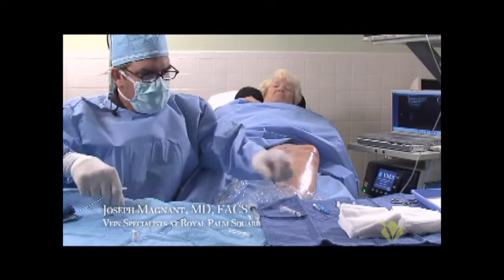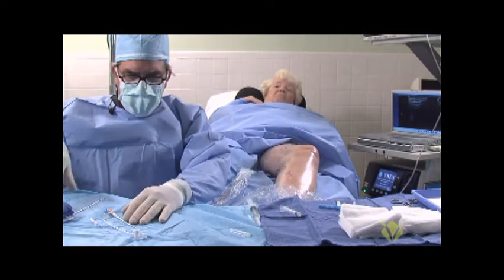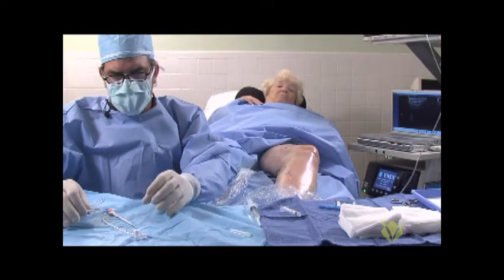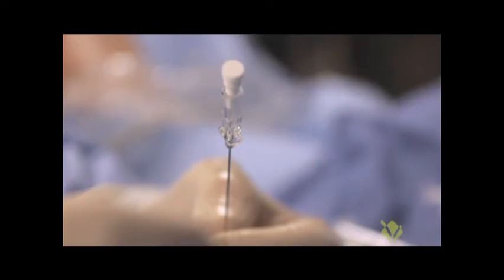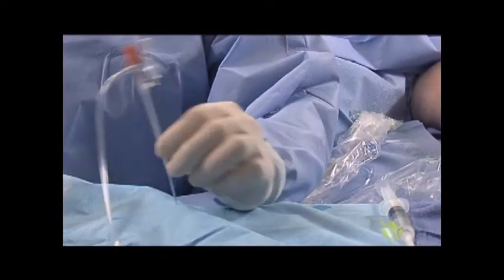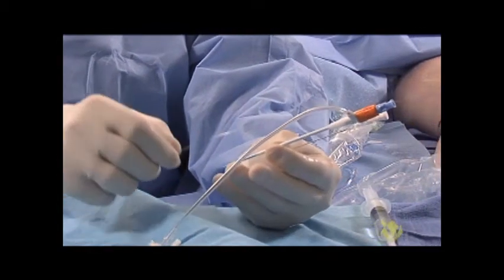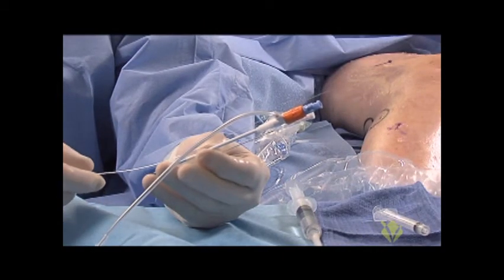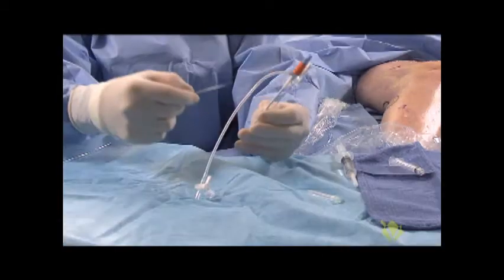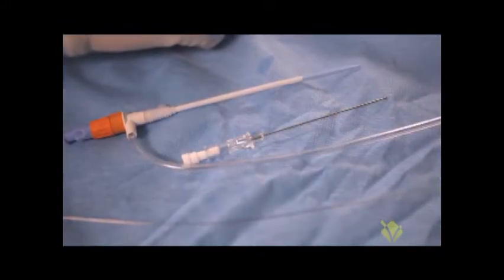The kit we use for the radio frequency closure — we actually open a separate 7 French microintroducer kit. So there's a 21 gauge needle, we have the 7 French introducer sheath for the radio frequency catheter, and we have our micro wire which is a floppy tip with a nice stiff mandrel on the end. That's the only thing for a radio frequency case that you need to open.